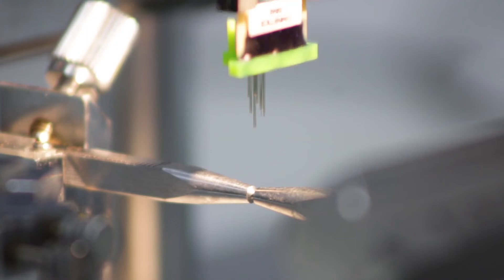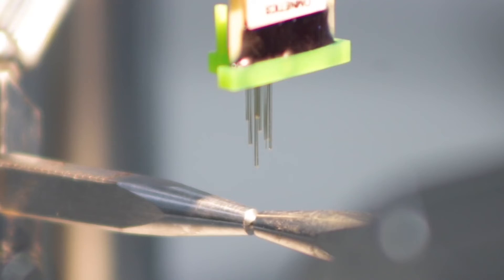Prior to the surgery, determine the interaural zero coordinate for all implants and guides. To do so, attach each electrode array that will be implanted to an electrode holder and set one micro wire to the interaural zero. This is where the ear bars meet. Repeat this for the additional electrode arrays and holders if necessary.